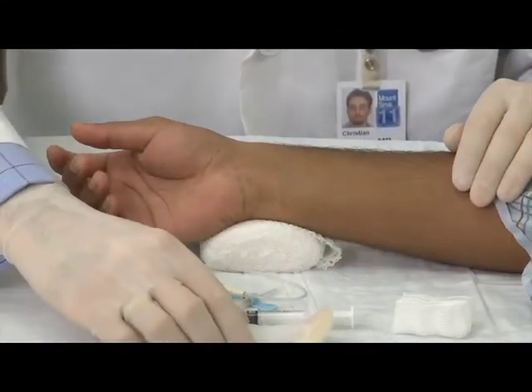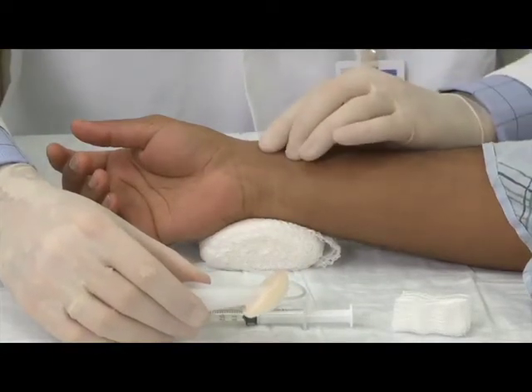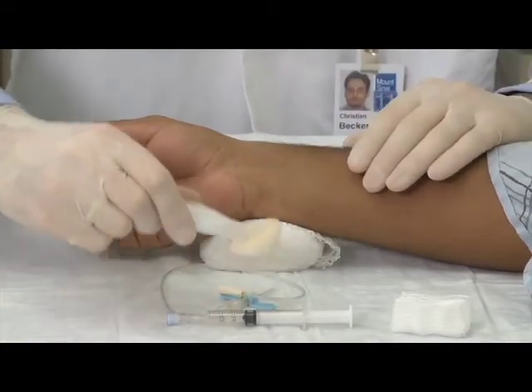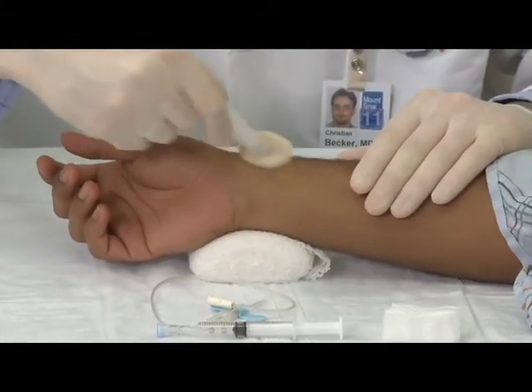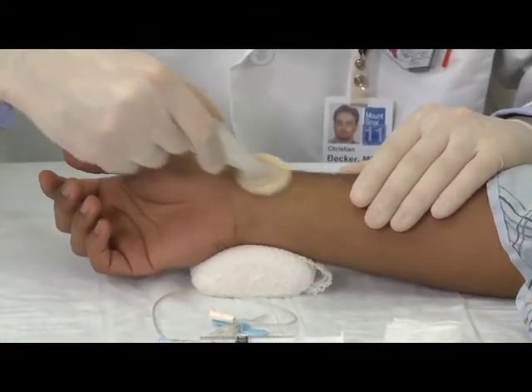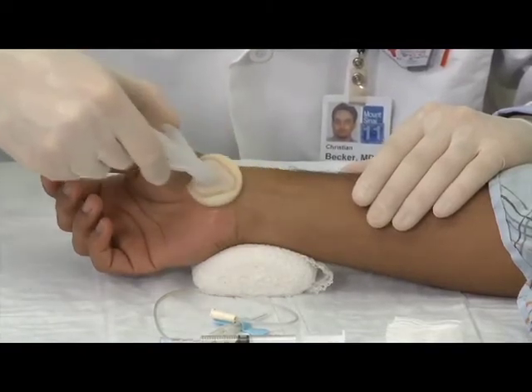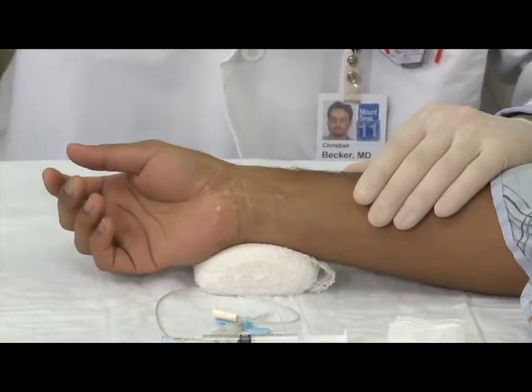Cleanse and disinfect the skin with antiseptic and sterilely prep the area. If desired by the patient, a local anesthetic may be injected intradermally prior to arterial puncture to reduce the discomfort associated with arterial puncture. Most patients defer on this option because it means an additional, albeit less painful, needle stick.